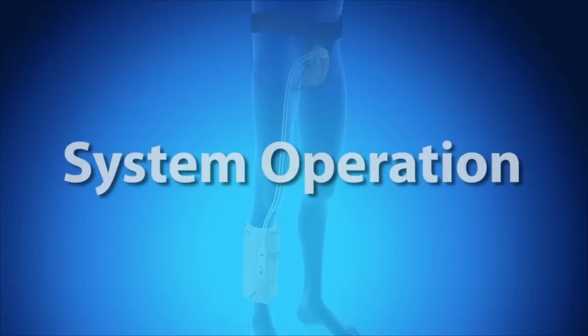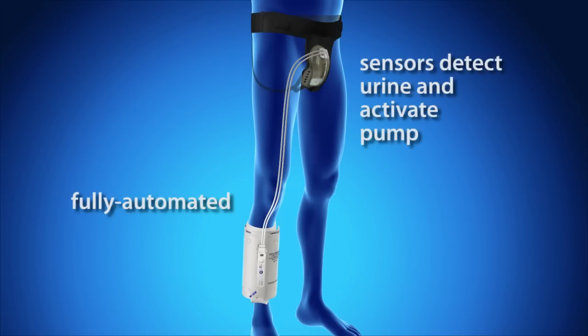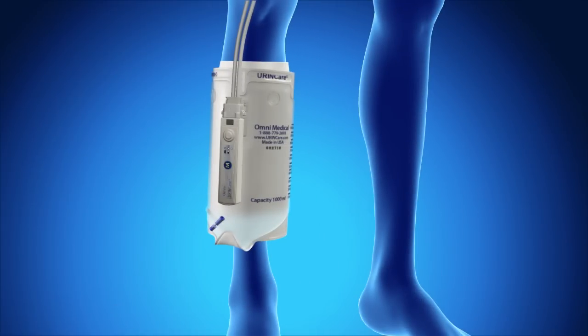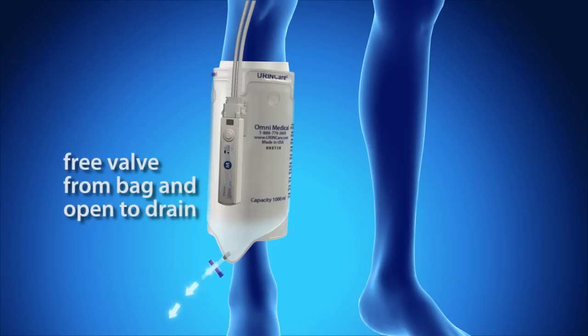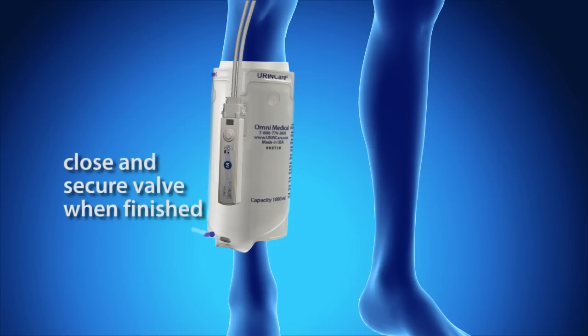System operation: The urine care system is fully automated. When the sensor detects urine, the system will activate, pumping the urine from the male cup into the collection chamber. To drain urine from the reusable collection chamber, free the T-valve from the chamber and slide the valve to drain. Remember to close and secure the valve when finished.